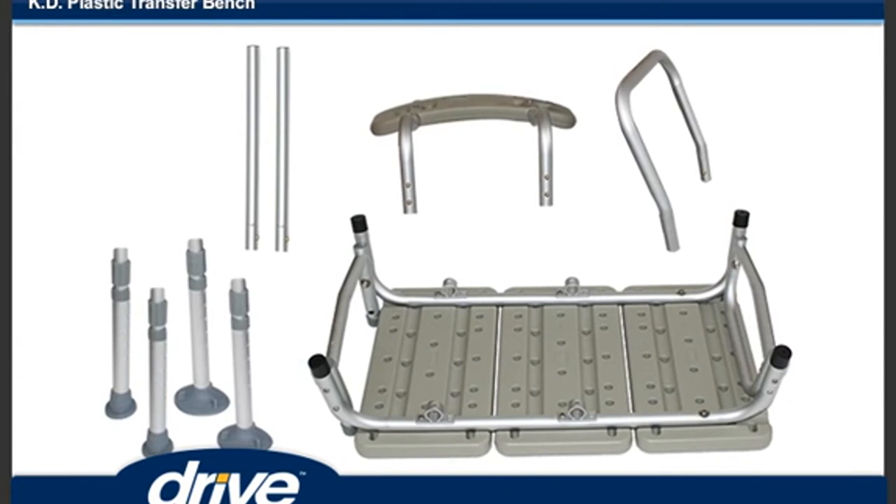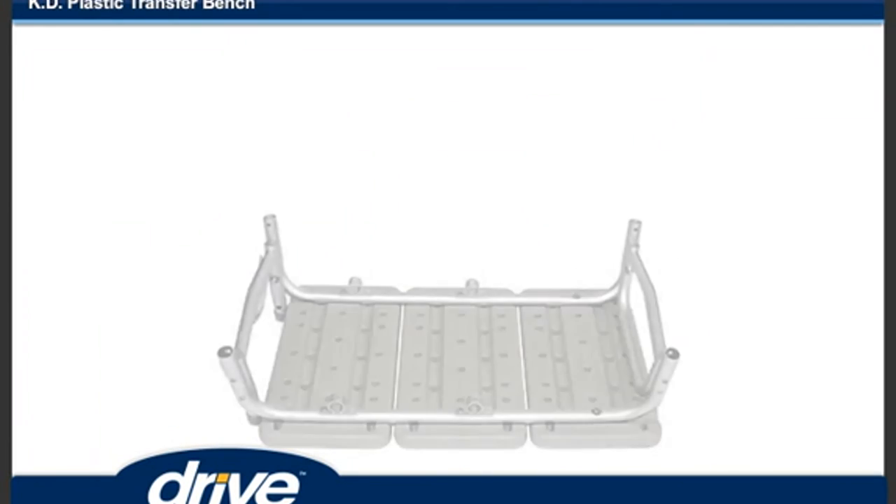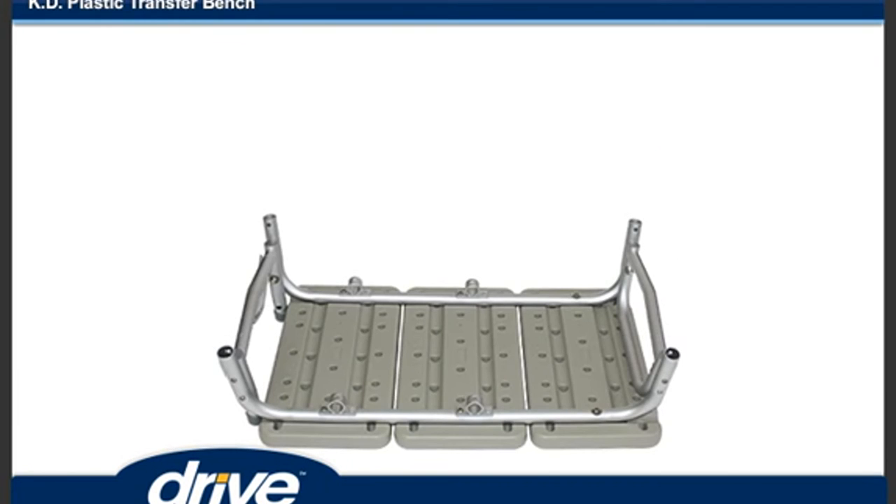Step 1: Remove contents from carton. Step 2: Lay transfer bench upside down on a flat surface.